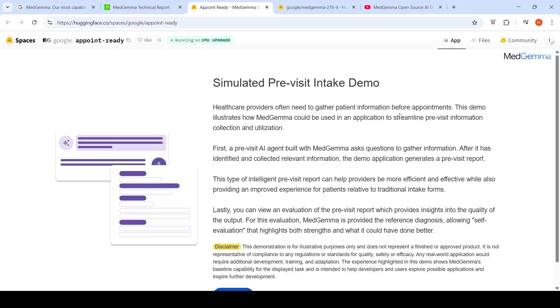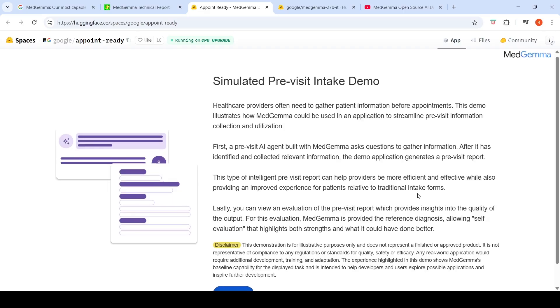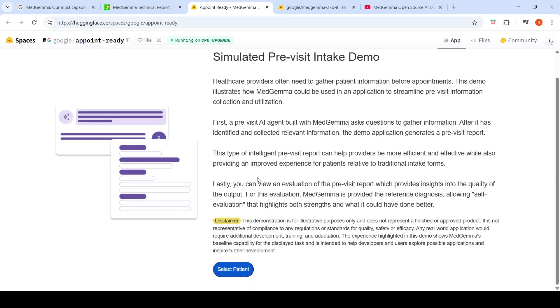Healthcare providers often need to gather patient information before appointments. This demo illustrates how MedGemma could be used in an application to streamline pre-visit information collection. A pre-visit AI agent built with MedGemma asks questions, gathers information, and then generates a pre-visit report. There is also an evaluation of the report for output quality, where MedGemma is provided the reference diagnosis allowing self-evaluation.